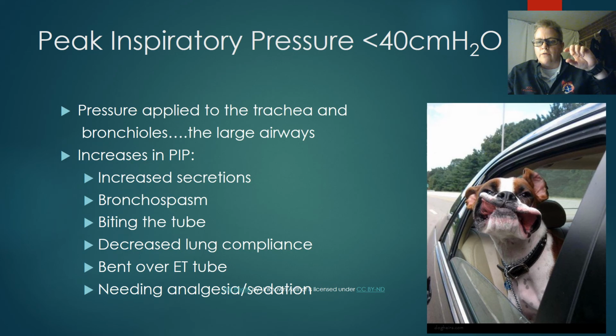So you know how our tube comes out of the mouth, and then we have our end tidal, and then we have the circuit, and that's huge. It's like a big giant thing. And what if that bends over? I've had to hold them up, so that it doesn't bend over. And then again and again, needing pain control and sedation.